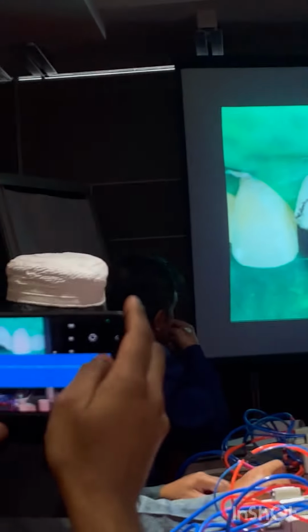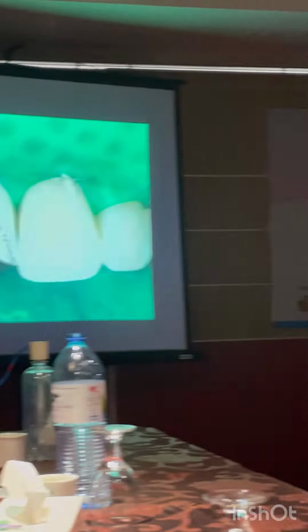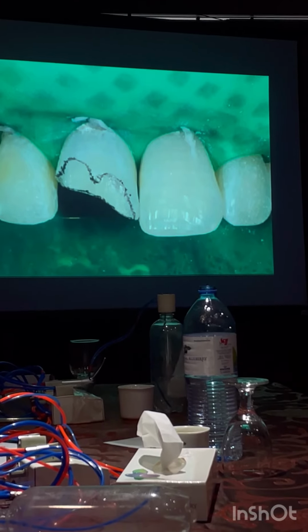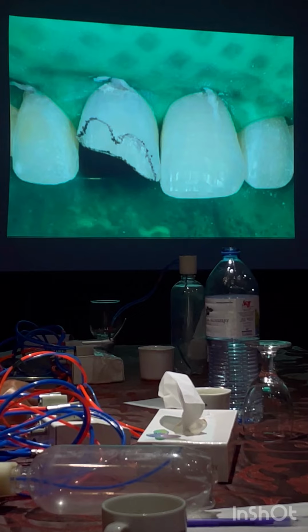See, when you give long bevel, you will get a line, correct? 45-degree plane, you will get a line. Over that line, you give this bevel. Curved bevel, or like a star. You can do anything, but break that line. Marking line, demarcation line. Demarcation line, you break it.